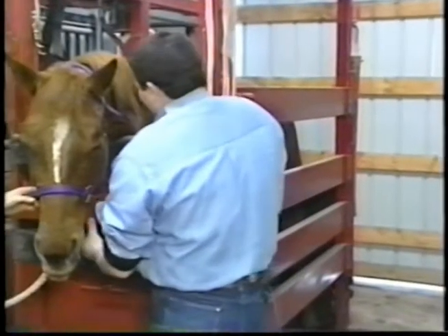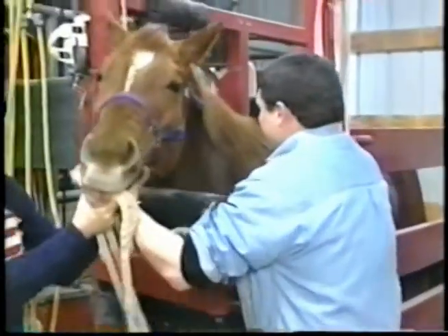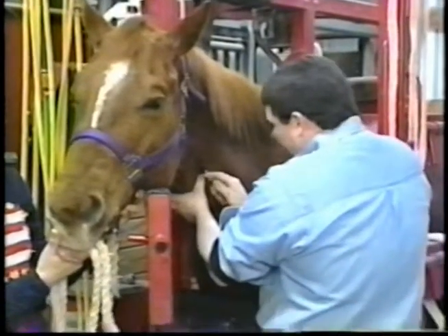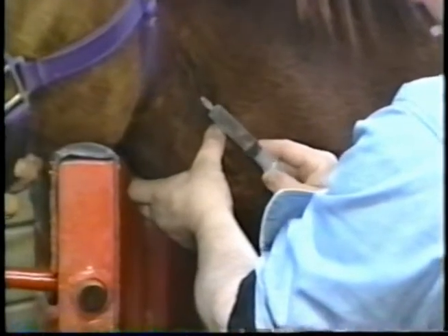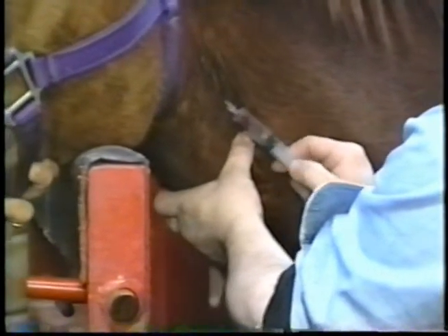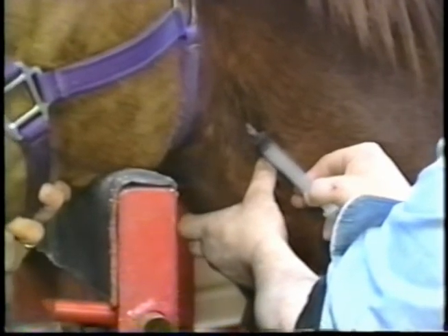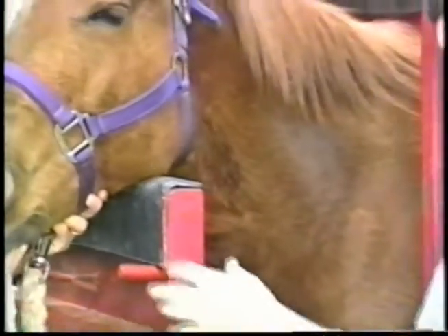Once your horse is done, we reverse all horses with yohimbine to reverse the effects of sedation for two reasons: one, to eliminate any side effects of sedation; and two, to allow you to be able to move or haul your horse within five to ten minutes after the procedure is done.